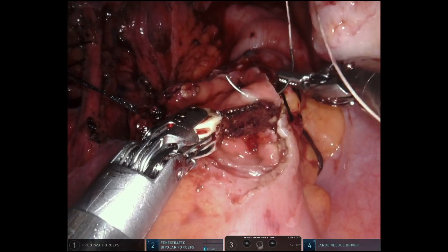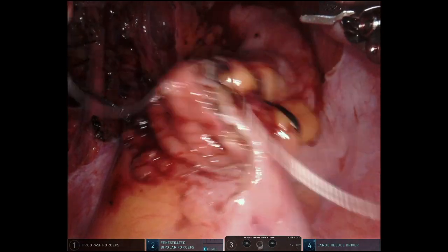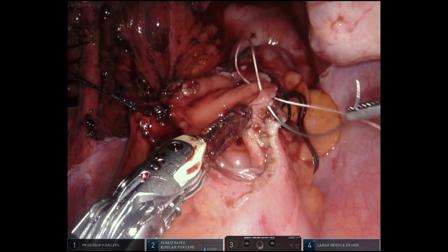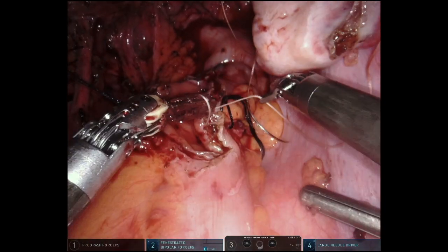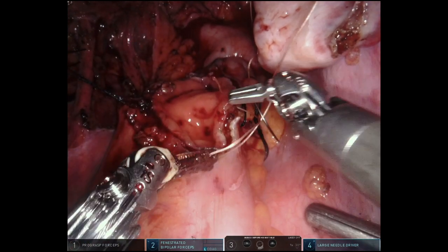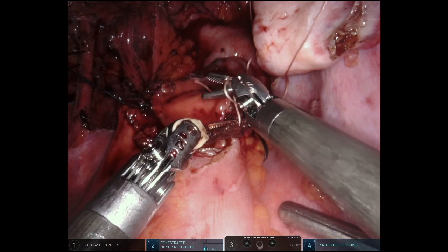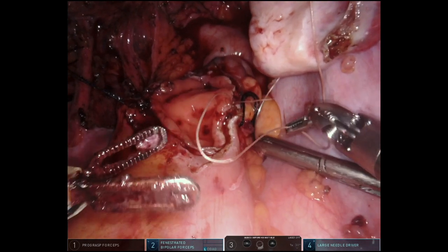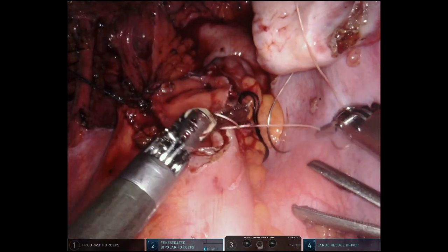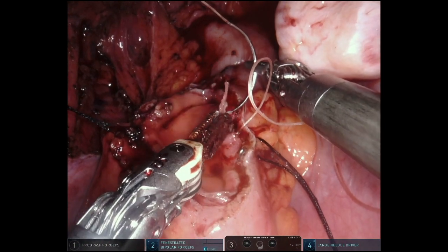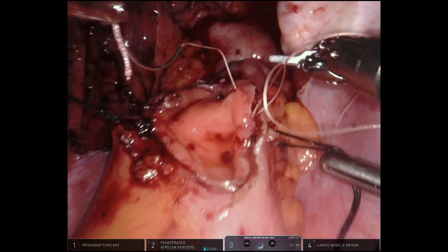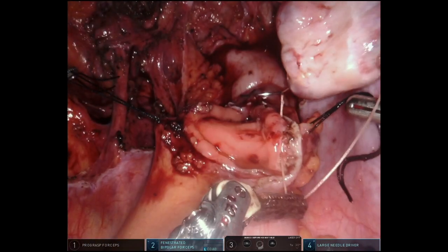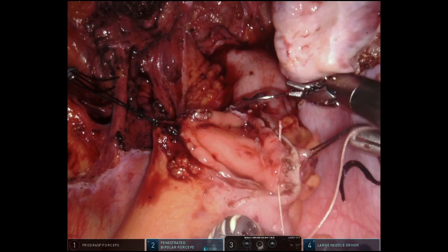The closure begins coming through the mucosa at 3 o'clock and then re-exiting from mucosa outwards just next to this. We elect to close the mucosa with a running layer of 3-0 Vicryl suture. It's important when using a running suture to make sure the suture comes in and out of the mucosa in a box-like fashion so that the tension on the suture does not constrict the final incision. Each suture is placed just in front of and then exiting just behind the last suture in an out-to-in, then in-to-out fashion. As the suture is pulled tight, one starts to see a slow closure of the incision transversely.